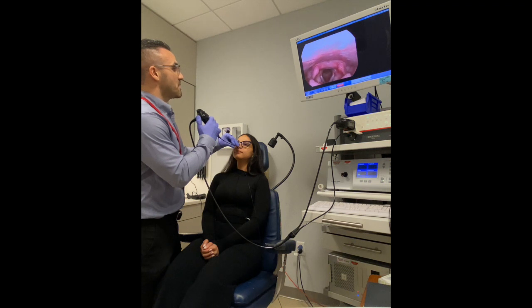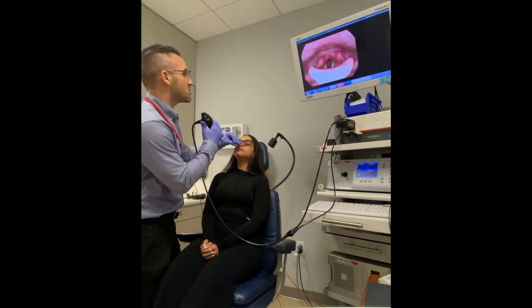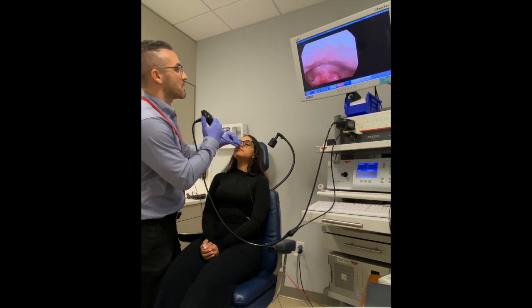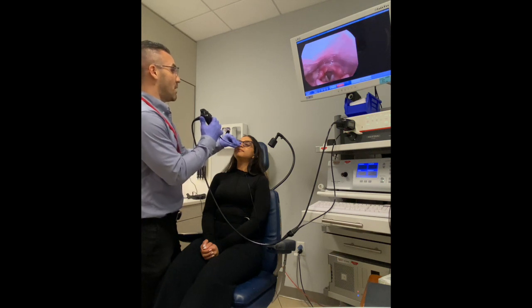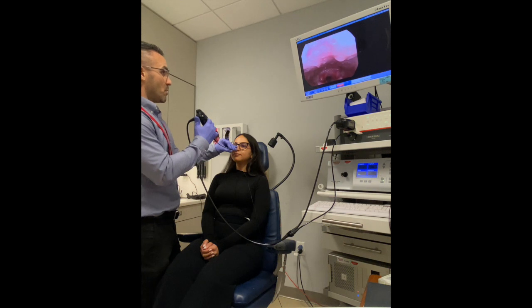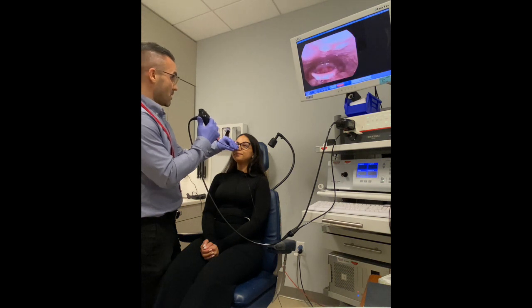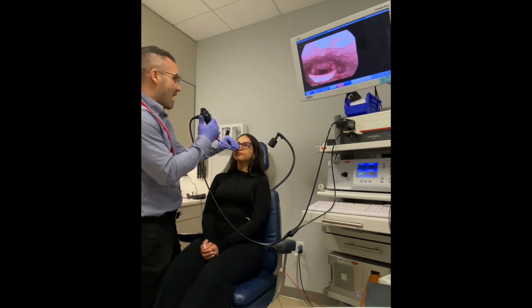Let's do it again — three more times. Hold your breath lightly. And relax. Keep your chin up. And if you can't do these last two, it's going to be a little weird — jut your jaw forward like that. And now hold your breath lightly. And relax. And the last one. Hold your breath lightly. And relax. You can put your chin back down. So we were having you hold your breath to see if you could close your vocal folds together. How many of those do you think you closed your vocal folds? Of those five? — All of them. — At least two of them you did not. A third one, I think you might not have either, or you kind of did and kind of did not. So about half of them you did, half of them you did not.